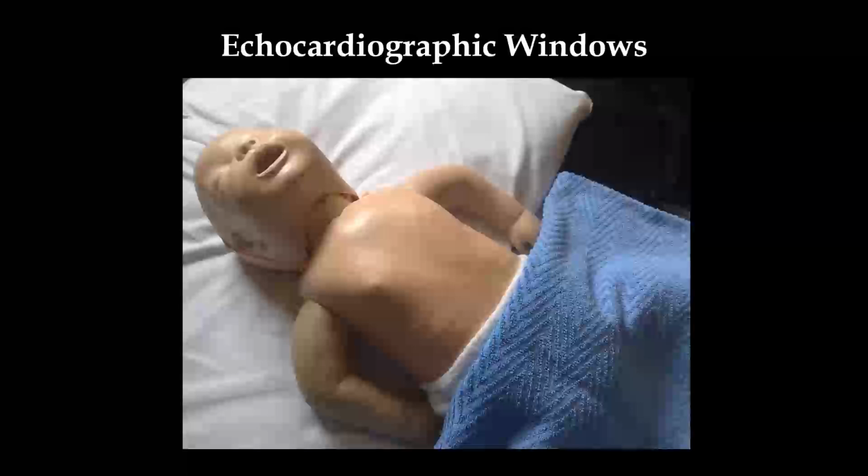Whichever window you choose, the only thing you should remember is that you should complete the whole sequence so that you cover all the views and structures and do not miss any. So whatever approach you choose, apical or subcostal or whichever, keep following that approach. One is the apical views, which is just below the nipple in the midclavicular line in the fifth and sixth intercostal space. There you see the apical views of the heart. This is the apical window. Then you have parasternal views.